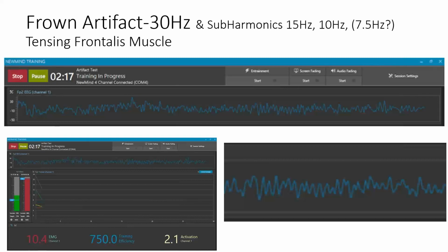So Rob has this thing where he has people go through and clench their jaw and frown and do different things, and he shows the clients the different types of things they can do to mess up the signal. And that's actually a really good clinical practice, because as a clinician, you can actually see what their unique signature is in each frequency band with our software. There's tense your forehead. Okay, now clench your jaw. Okay, move your head backward and forward, and you can see which area produces the most muscle tension.